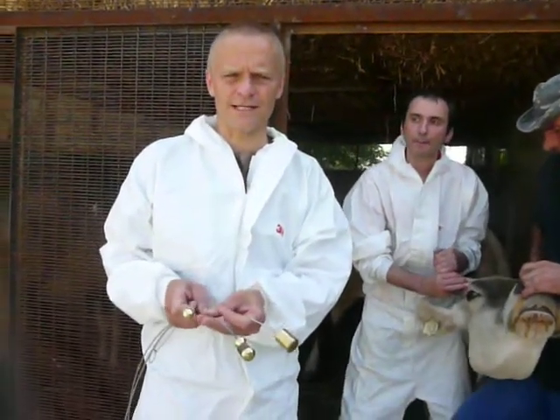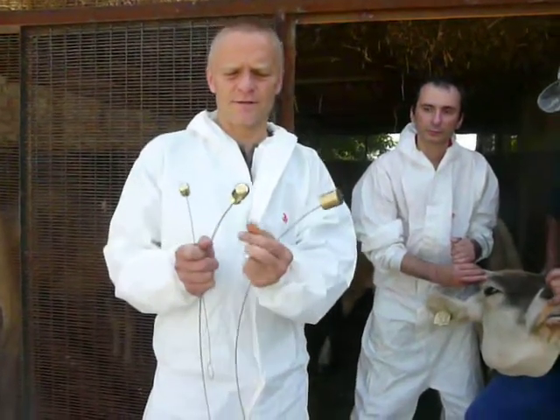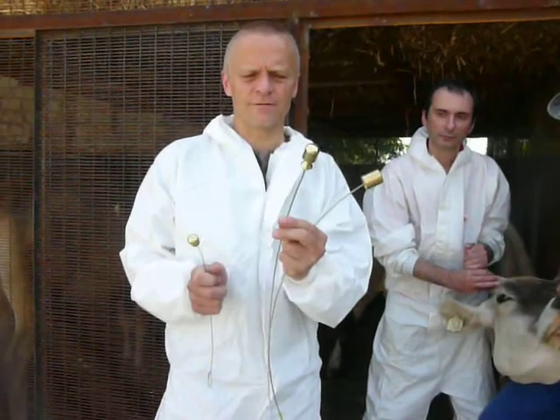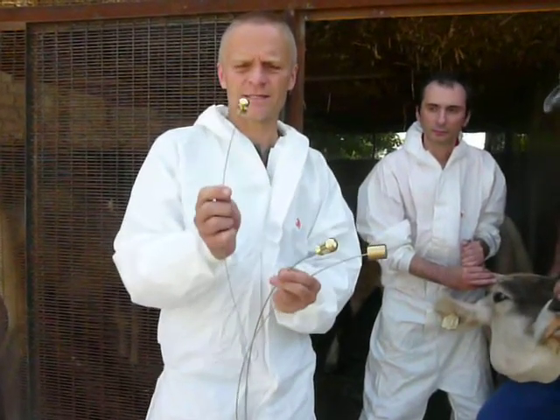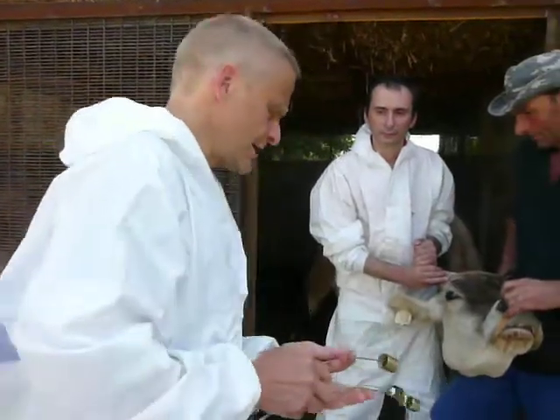We have three different probing devices. The biggest one is for cows, the smaller one for calves, and this is the smallest for sheep. We have a big cow here, so we use the big one.